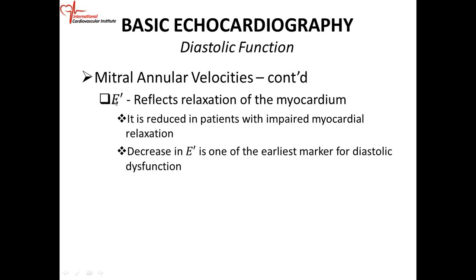Important point: E prime reflects relaxation of the myocardium. So remember that. It gives you information about myocardial relaxation, and it is reduced in patients with impaired myocardial relaxation. So if the patient has a problem with the heart muscle relaxing, the E prime is going to be reduced.